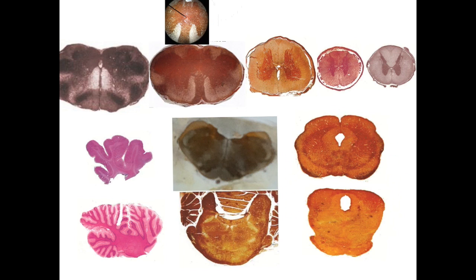Try to differentiate between the midbrain sections. This is the superior colliculus, in which we have the inverted pear gray matter. But this is the inferior, and we have a rhomboid-shaped gray matter and here we have a basis pontis, but here we have the two crus cerebri completely separated from each other. Here you can see this angle of the basis pontis on which the midbrain rests, and it is very evident in front of this, in addition to the rhomboid-shaped gray matter. But here it is an inverted pear, and even the central canal or cerebral aqueduct of Sylvius looks like an inverted pear also. So this is the midbrain superior and this is the midbrain inferior.